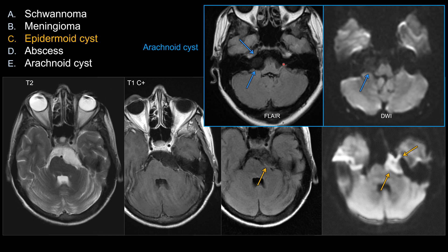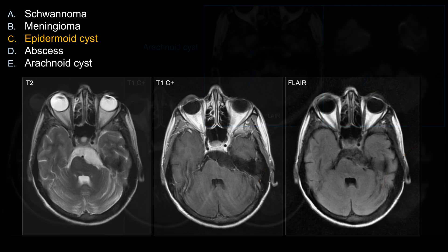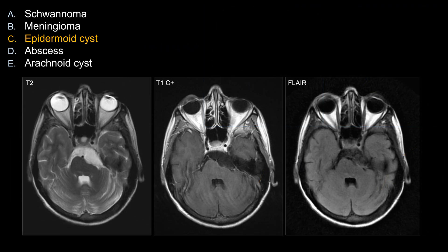Here is an example of an arachnoid cyst. The key feature is that it should follow CSF on all sequences — it should not enhance on T1-weighted sequence. On FLAIR, it should show complete suppression of CSF signal, just like CSF anywhere else — not the dirty FLAIR appearance seen with epidermoid. And it should not have restricted diffusion. That concludes this case.